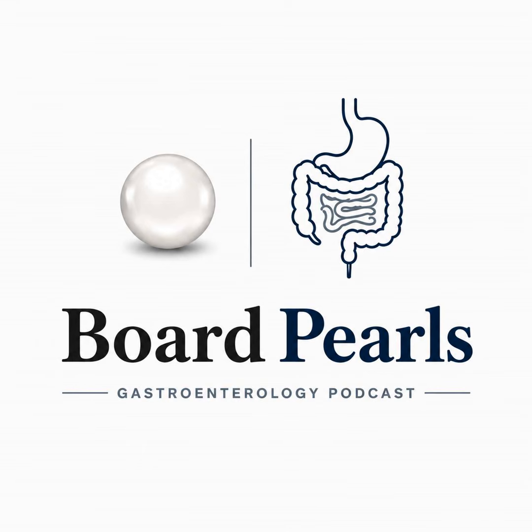For sessile lesions and lateral spreading lesions 10 mm or larger without high-risk features, endoscopic mucosal resection is the standard. The technique is to inject submucosal fluid until the lesion lifts off the muscularis propria. The fluid is usually saline with indigo carmine or methylene blue, sometimes with dilute epinephrine. Then snare resect the elevated mucosa above the cushion.